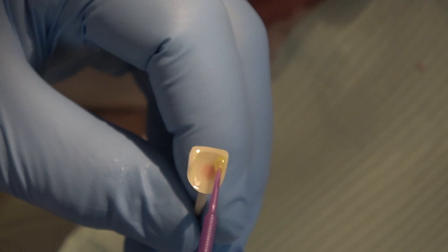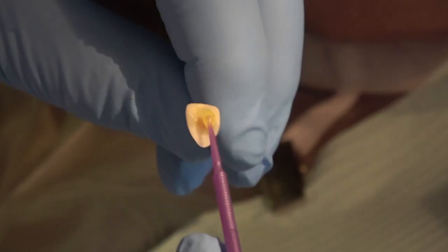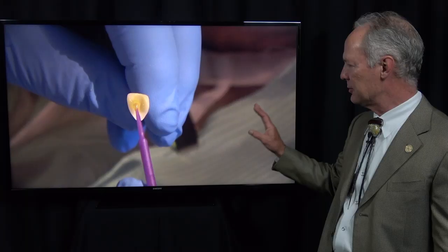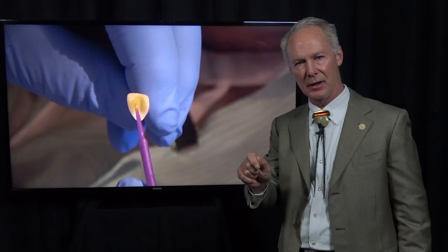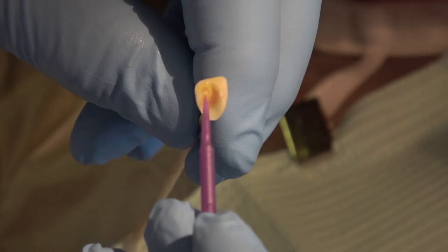See the great hemostasis from the 38% phosphoric acid. Then place the primer adhesive on the tooth side of the veneers and blow the excess off. And you don't want anything wiggly on there. These are so strong. Watch my video in the Library of Dentistry Master Classes on how to make veneers as strong as natural teeth. When I cut a couple of these off one time, you have to cut every little tiny bit off. They do not fracture off. These veneers truly become as strong as natural teeth if you use this technique. But you've got to use it specifically. Then blowing all the excess off.